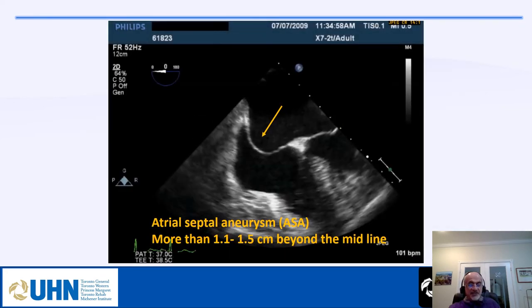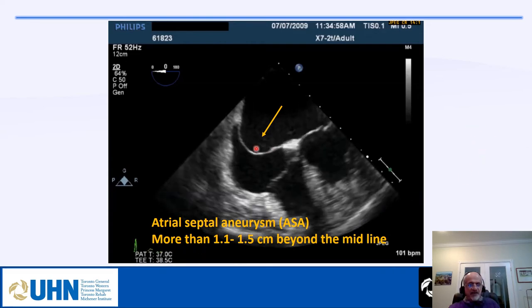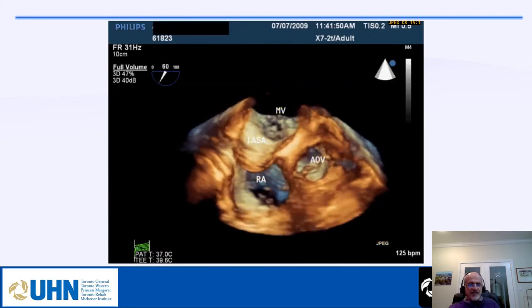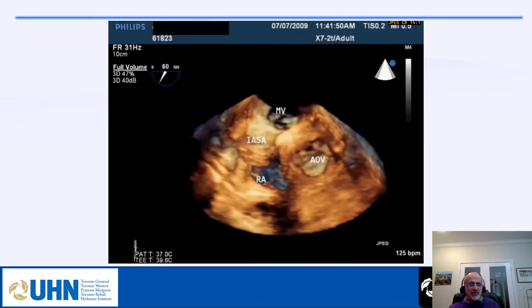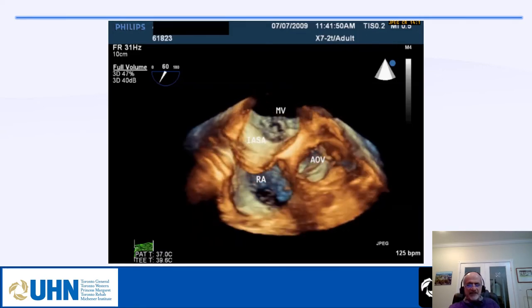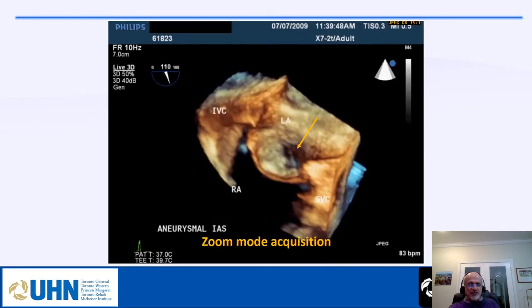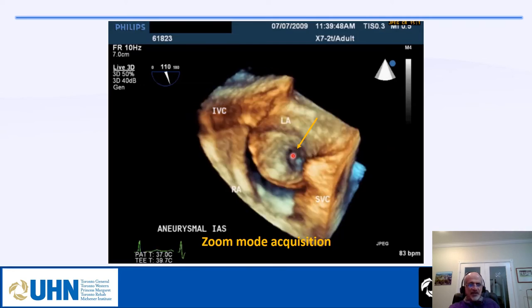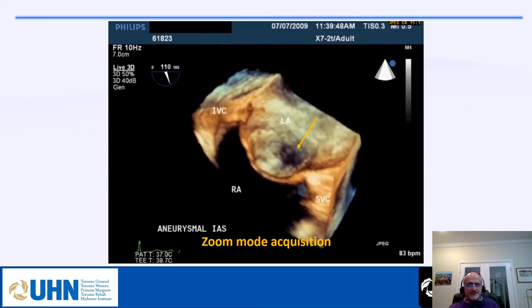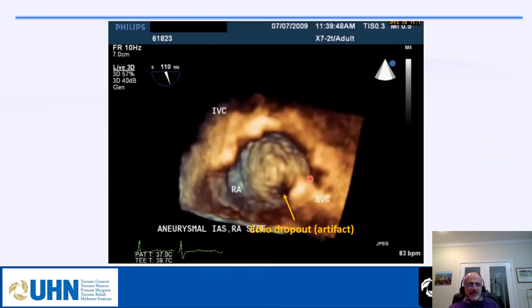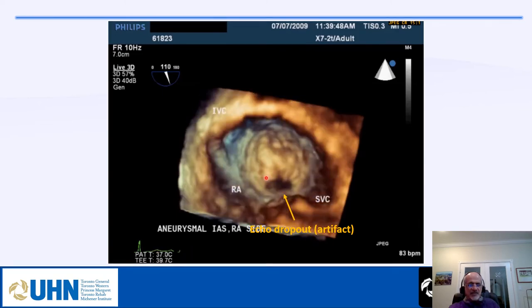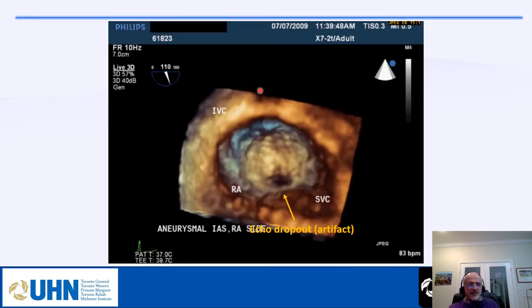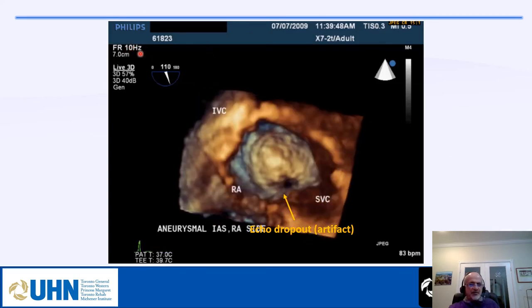There are challenges in displaying the interatrial septum. One is the aneurysm of the interatrial septum. Another challenge is that our frame rate is low compared to 2D — we might see a hole that is not a real hole, but rather an artifact due to low temporal resolution. From the right atrium side, you may see an apparent hole with no ASD — this is a dropout artifact from low temporal resolution, here only 10 frames per second.